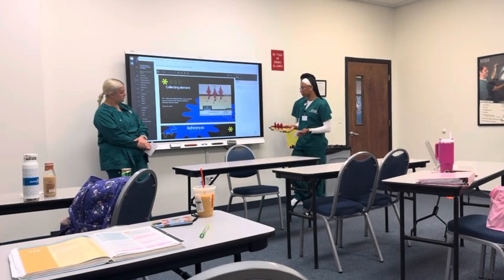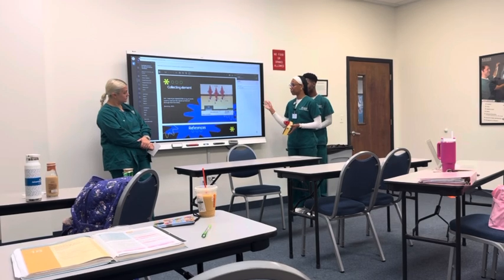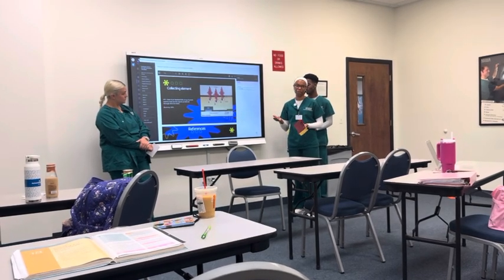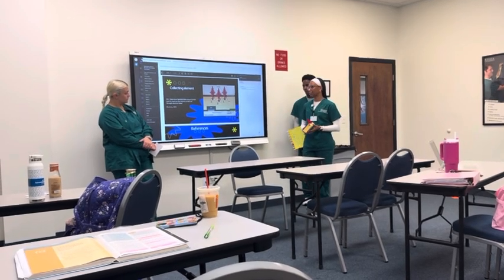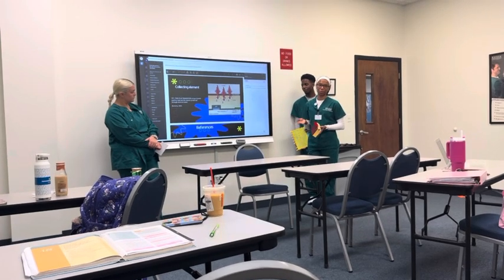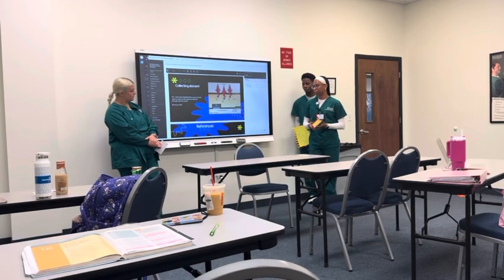With that, that's really all there is to that, but with how this works, if anything happened in the system, like anything broke down, you end up having to replace the whole panel. That's the reason why direct is not always commonly used in general radiography. It's not convenient. It's super expensive. We only basically use it in mammo because of the high spatial resolution, and that's kind of it with it.